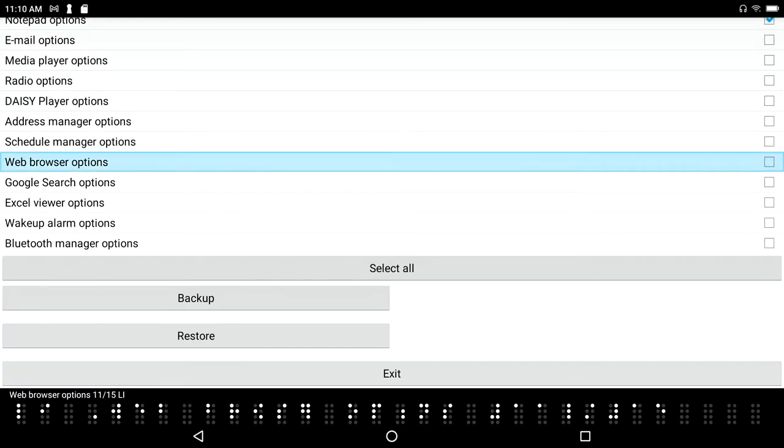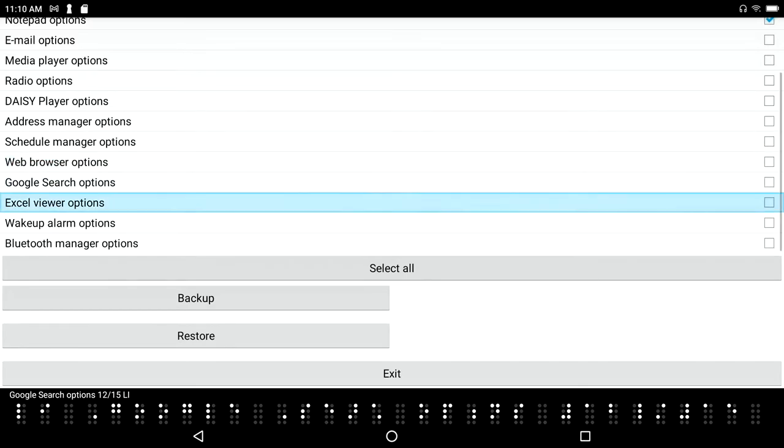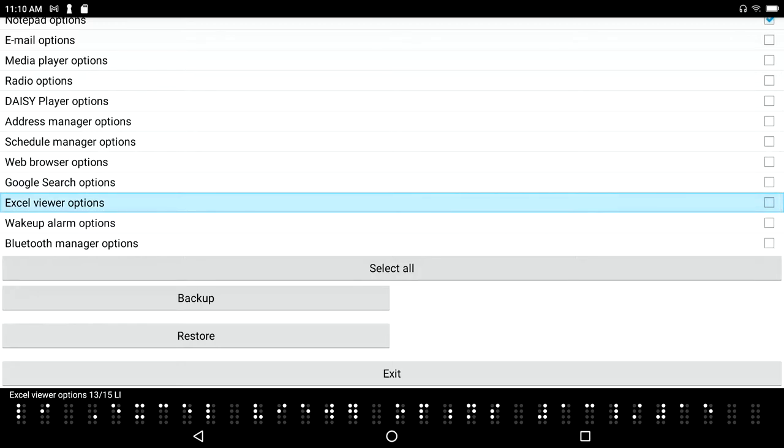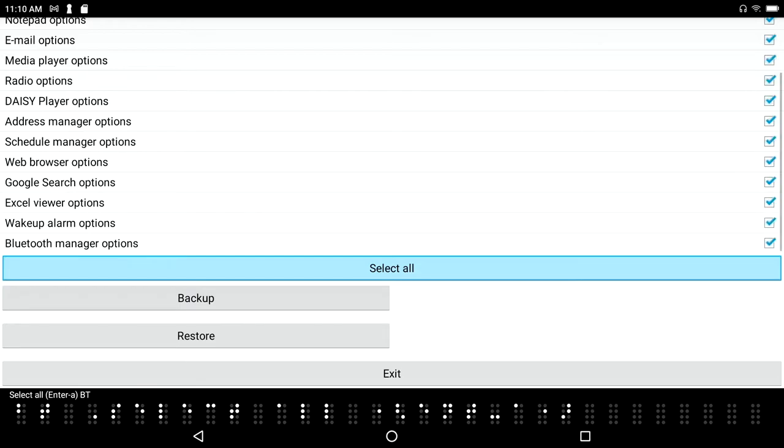Schedule manager options, web browser options - and for whatever reason if they don't, it's no big deal because you can always go back in and set this again and then do the backup on your new device. Google search options, Excel viewer options. So I'm just down arrowing or pressing space with dot forward down through the list.